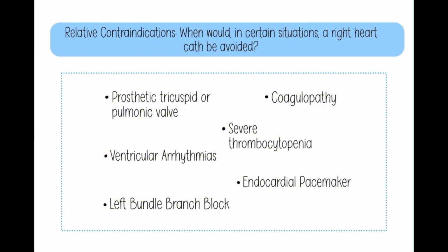Ventricular arrhythmias, because anytime we are putting equipment inside of the heart, especially in the ventricles, we can cause PVCs. And if they already have underlying issues with ventricular arrhythmias, then we could trigger that response.